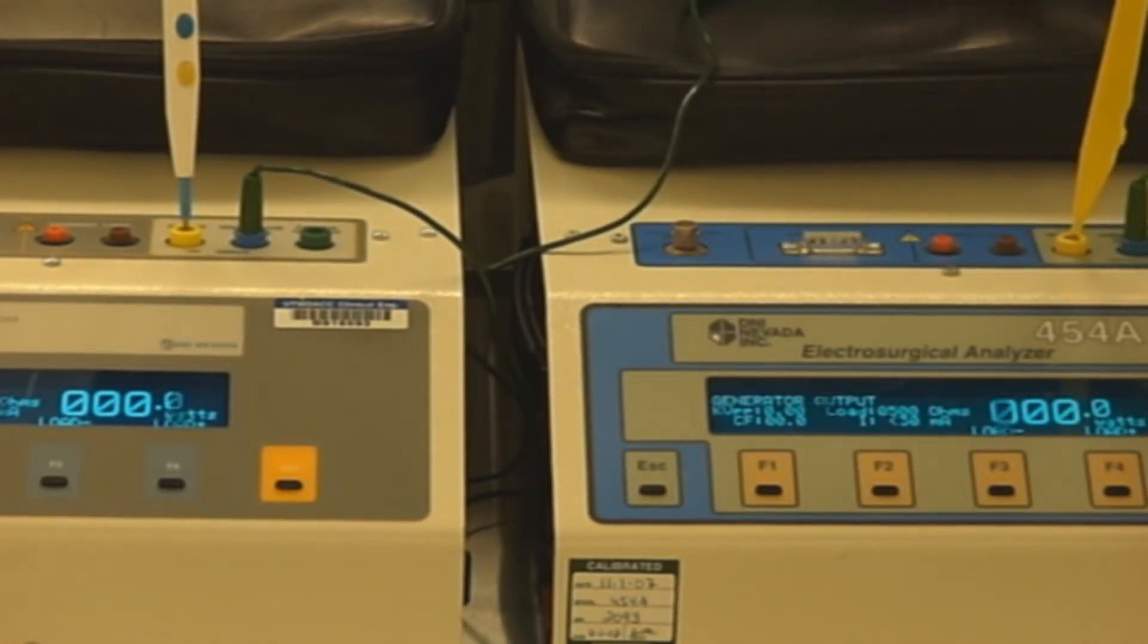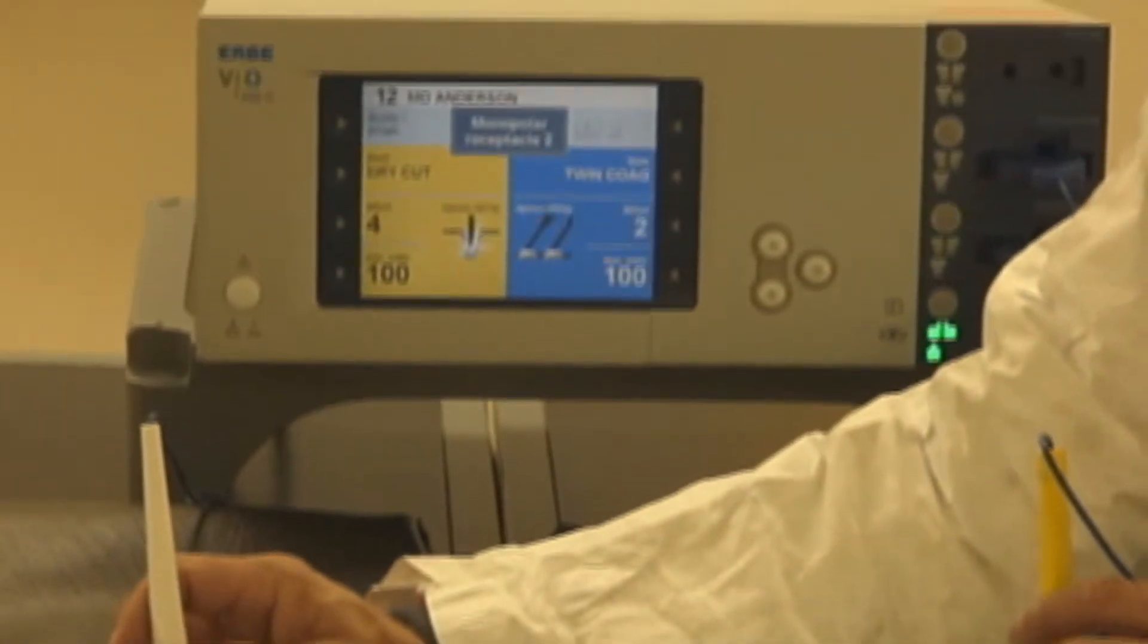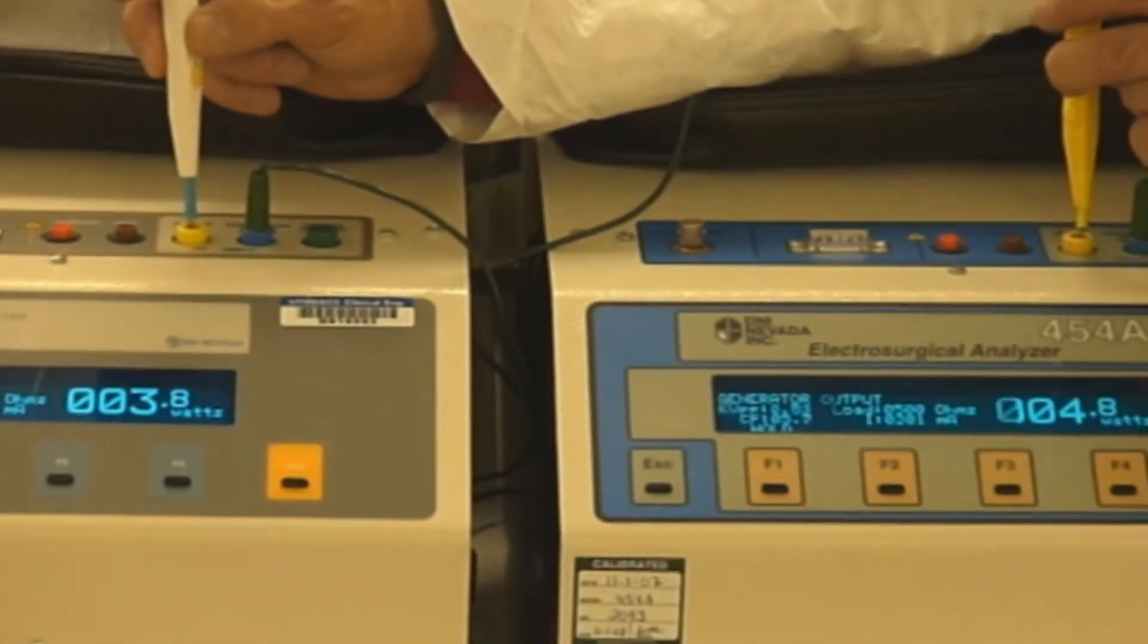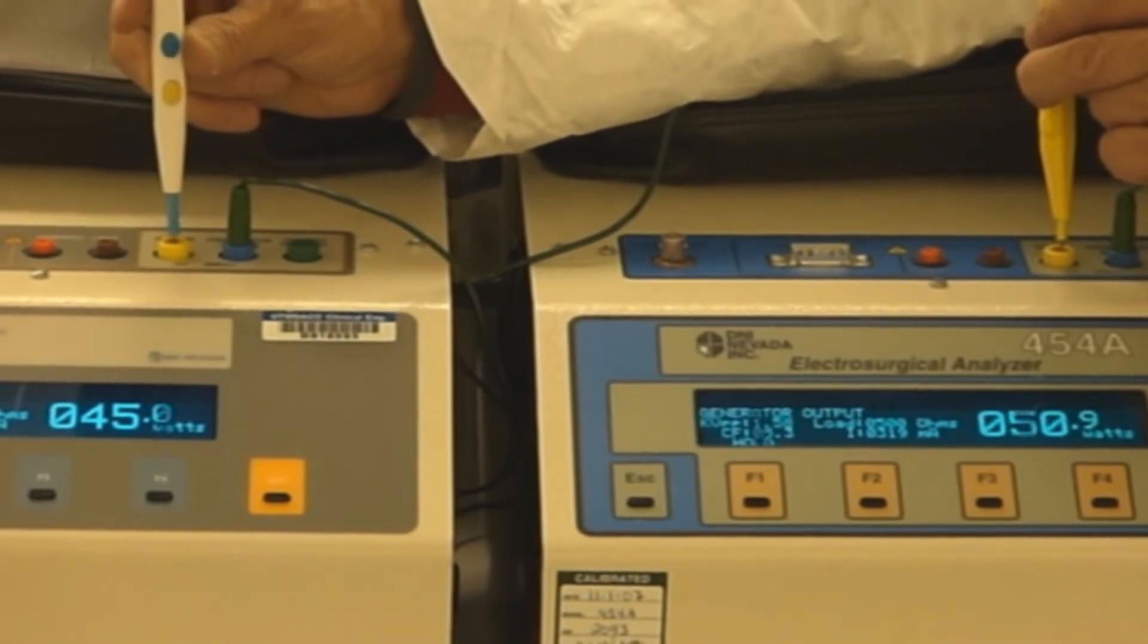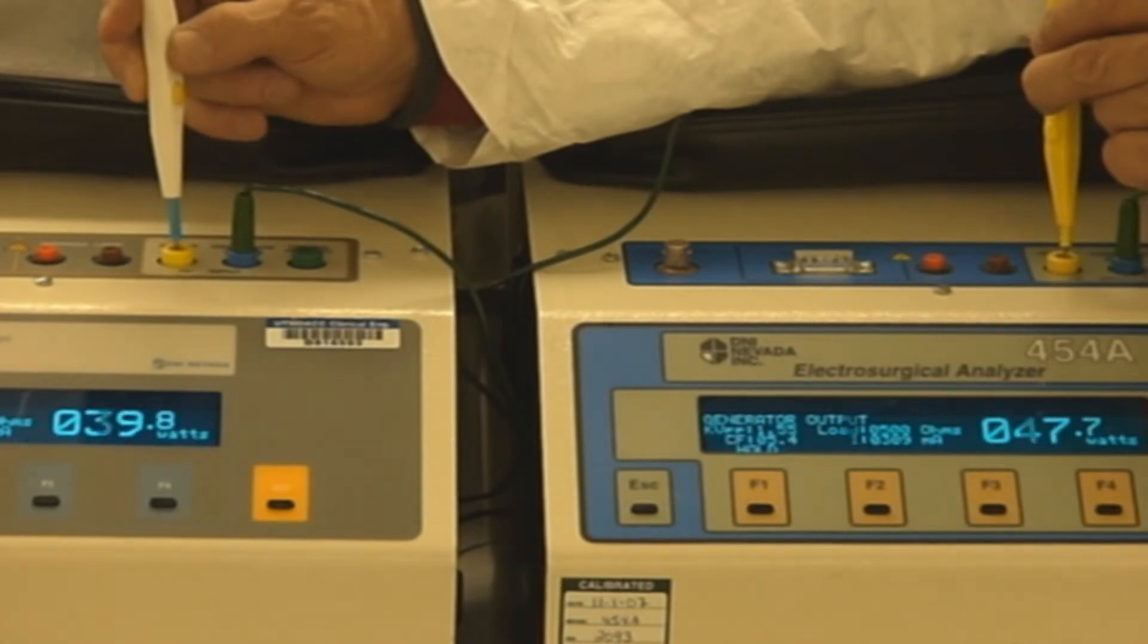Now let's do effect two. We won't even bother with one, should I just use that one? Here we go, effect two, 100 watts, 500 ohms on both units. There it is, there's the split. Now we're going to go ahead and, there's the shift. Surgeon one comes in.